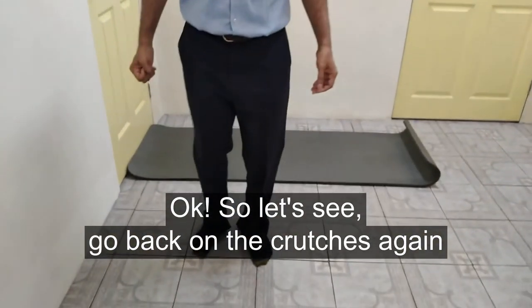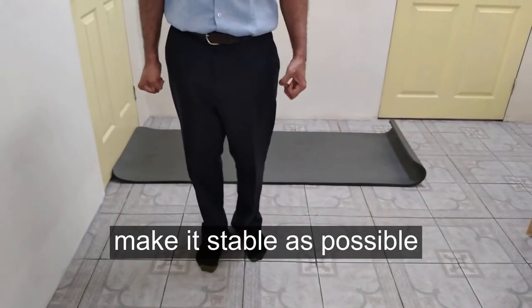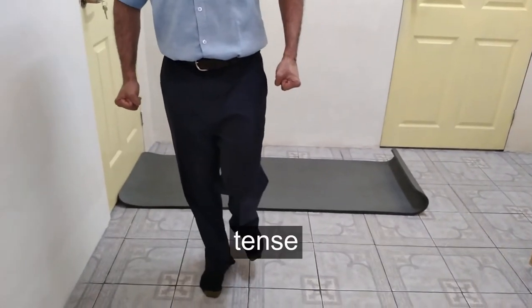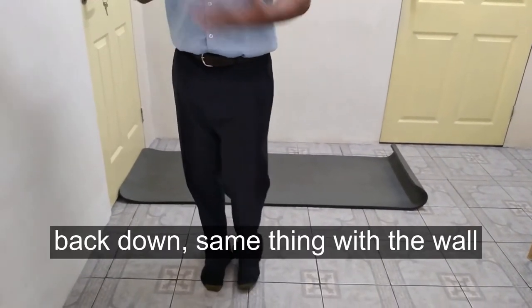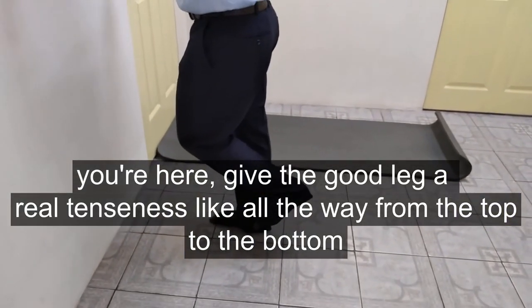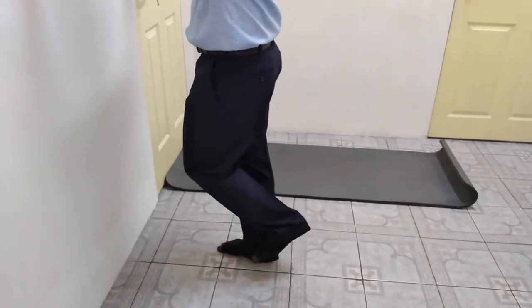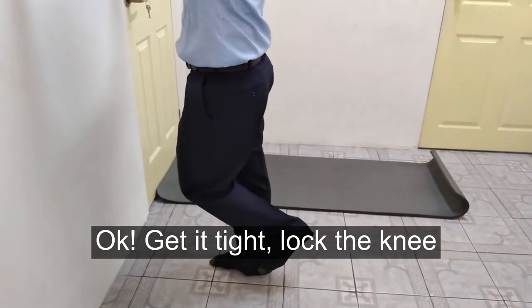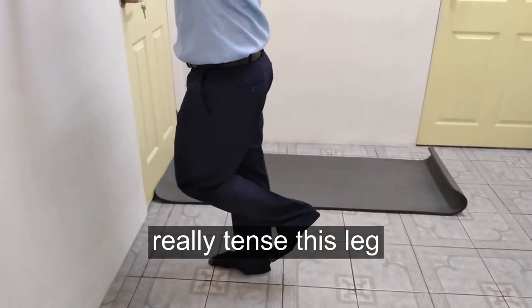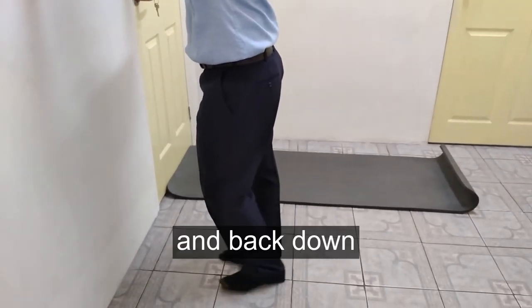Back on your crutches — lift the good leg and tense up the bad leg, making it as stable as possible. As you lift the good leg with the crutch, tense the leg. Same thing with the wall: lift the good leg and really tense the leg all the way from top to bottom. You should feel your toes grip into the floor, lock your knee, and come back up. Really tense this leg and feel the toes grip into the floor.